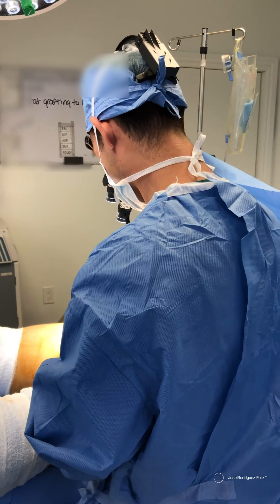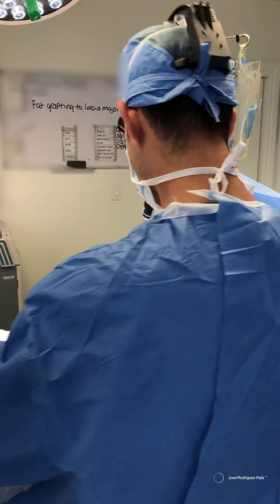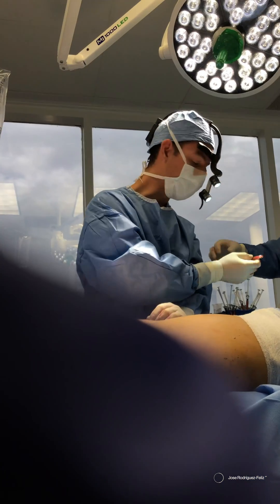Now we are injecting the fat grafting that we processed into the area of the mons pubis.